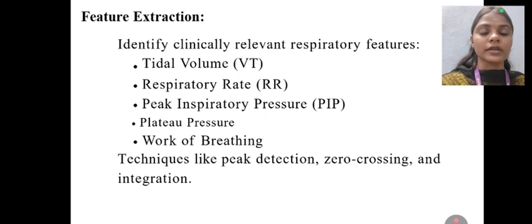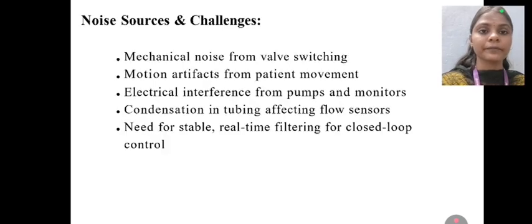And the feature extraction. The features identify clinically relevant respiratory features like tidal volume, respiratory rate, peak inspiratory pressure, plateau pressure, and work of breathing. Techniques like peak detection, zero crossing, and integration are used to extract these features.